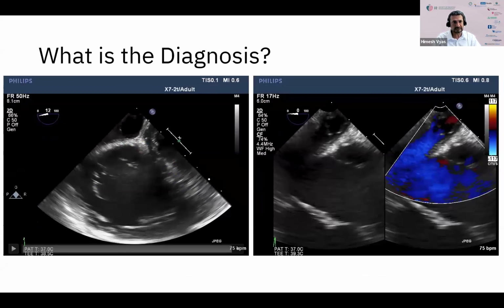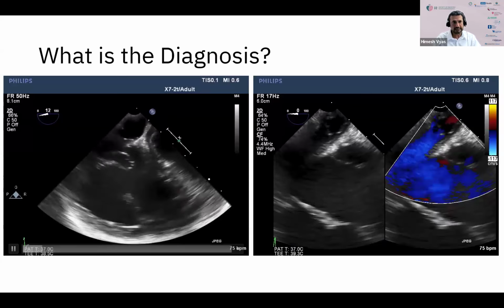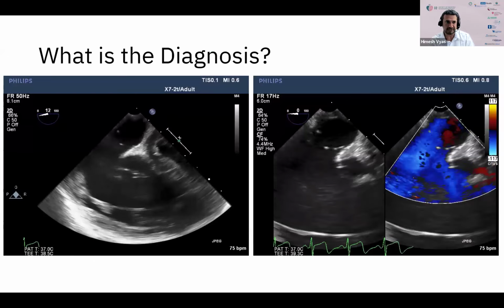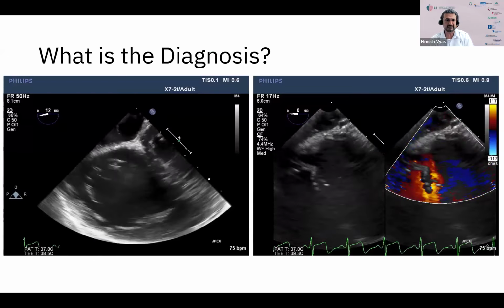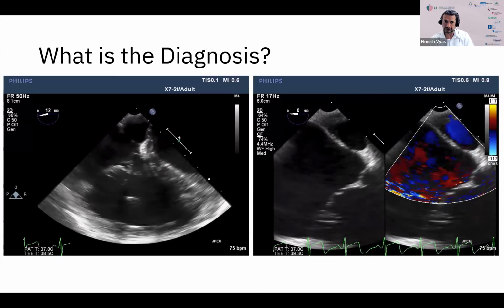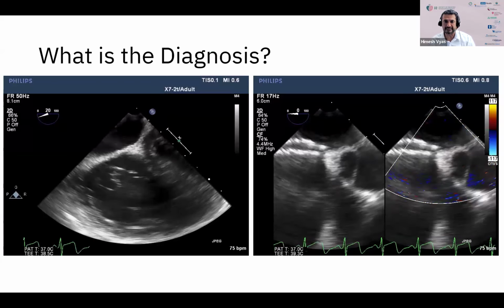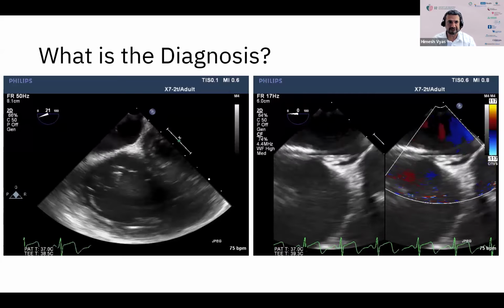The coronary sinus looked prominent. There was copious flow coming in from the coronary sinus as well. We knew that there's not a left SVC. This was strongly suggestive to us of potentially an unroofed coronary sinus or a coronary sinus type defect.